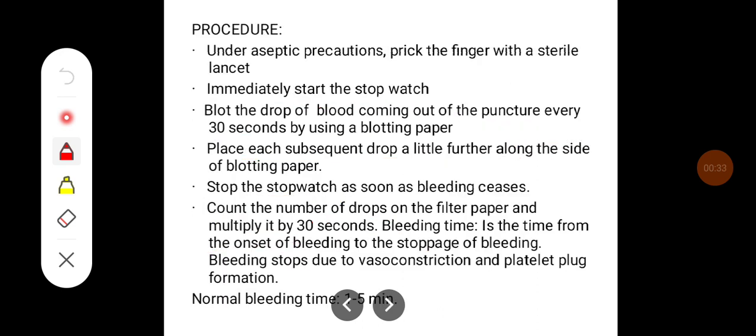The procedure is very simple. Under aseptic precaution, prick the finger with a sterile lancet, then immediately start the stopwatch. Blot the drop of blood coming out of the puncture every 30 seconds using blotting paper. Place each subsequent drop a little further along the side of the blotting paper. Stop the stopwatch as soon as bleeding ceases.